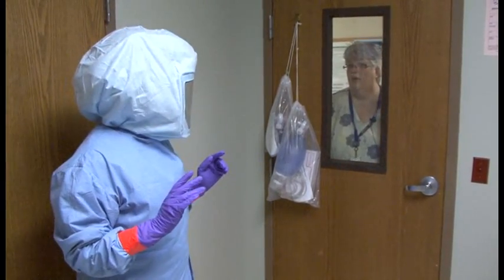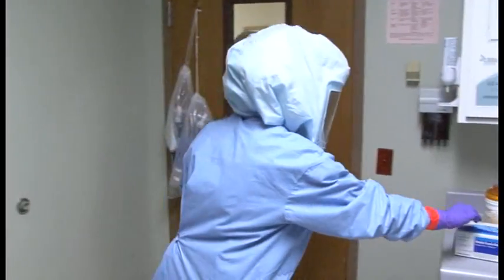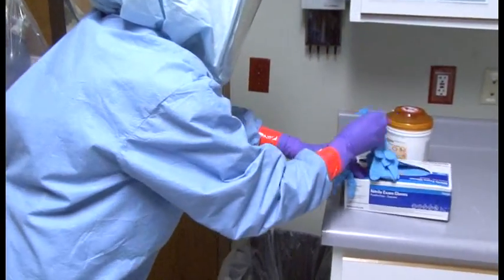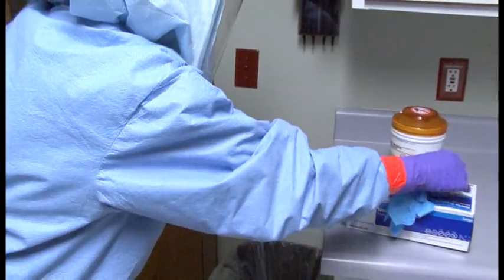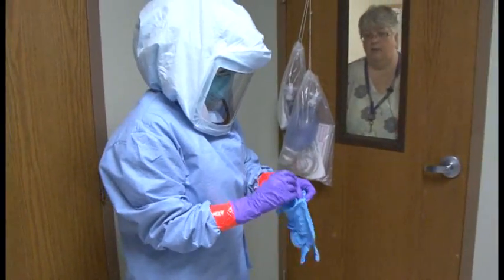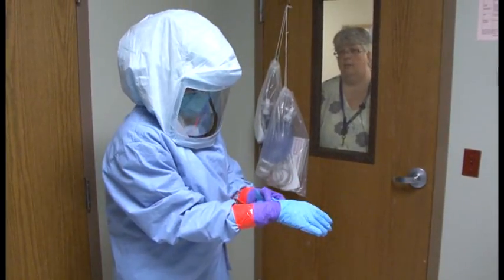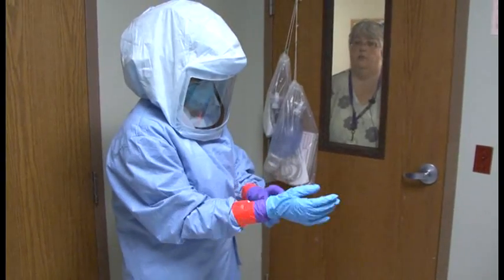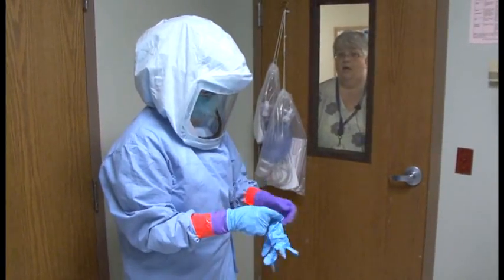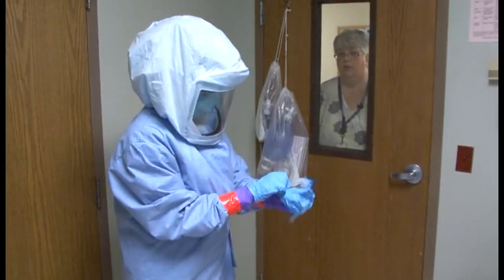Before taking care of the commode, Lynn will put on a third pair of gloves over the top of her purple nitrile gloves. Gloves are kept in the room for this purpose. A third pair of gloves should be worn any time you are handling anything involving blood, urine, or feces, or when drawing blood specimens. They are put on in the room and taken off in the room before getting ready to leave.